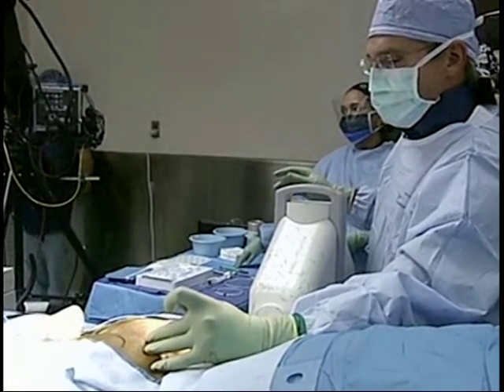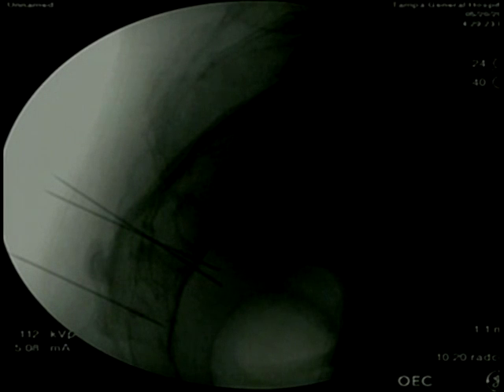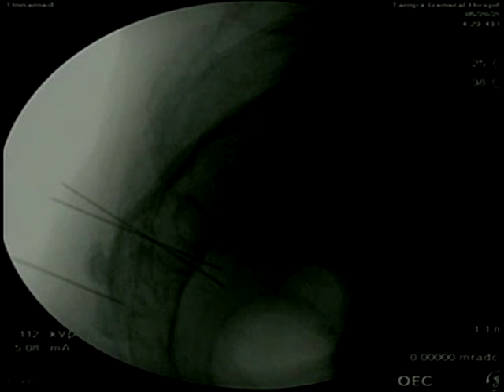Dr. Odorica is trying to place the needle. On the fluoroscopy you can see him passing the needle just below the other two needles, entering the foramen. He'll try to get it just below the surface of the bone so he can stimulate right where the nerve runs below the foramen. This is a very safe procedure — there are no major structures that can be damaged as he passes the needle. He's trying to get into that inner corner to get the best results from stimulation.